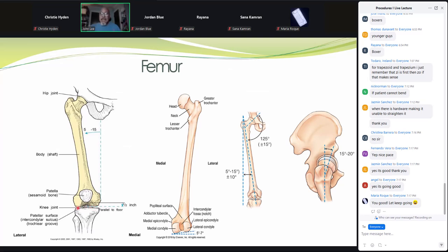This is normal gait. When we're doing standing knees, and I've seen this on many a discussion board, the big question is, if we're doing a lateral weight-bearing knee, do you angle the CR 5 degrees or do you keep it horizontal?